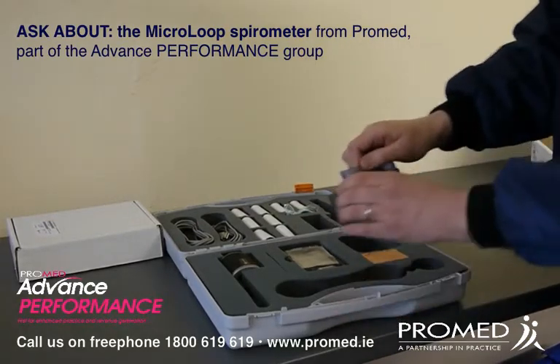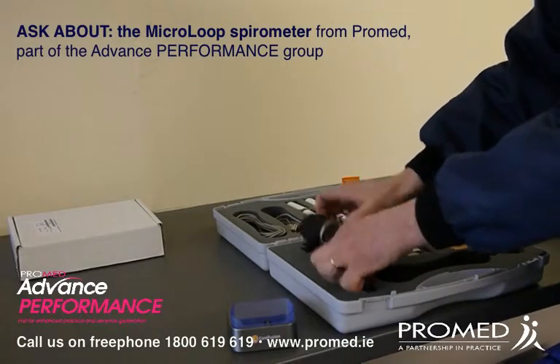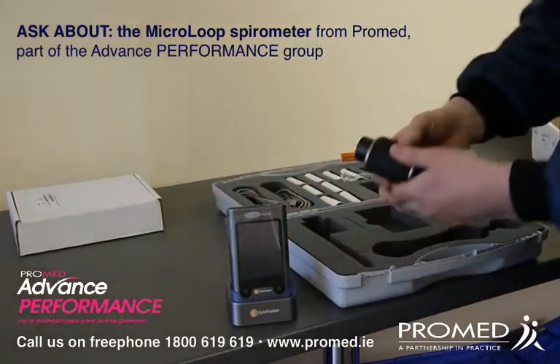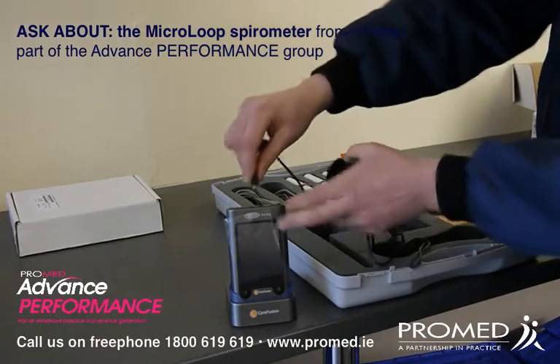Now you have the cradle that holds the device. You'll have the measurement head. And you'll have the device itself. So you'll be able to plug in your measurement head and get started with the unit.